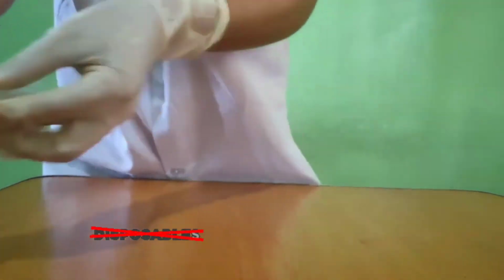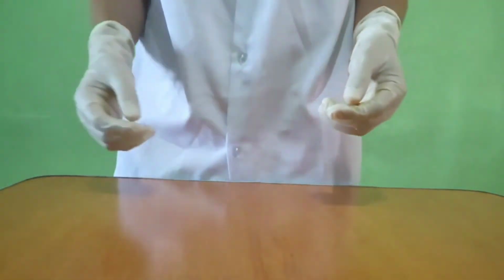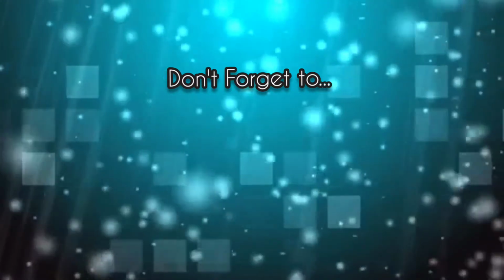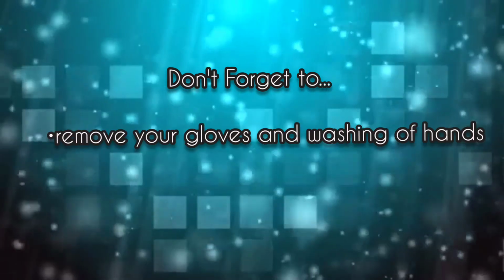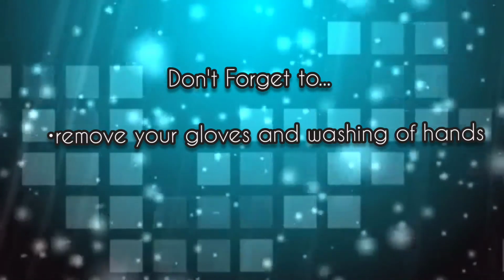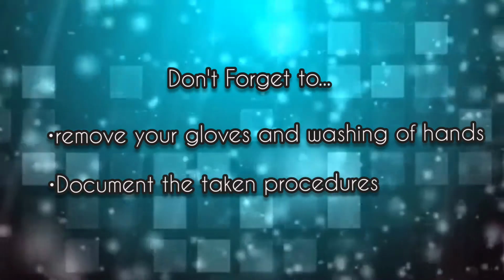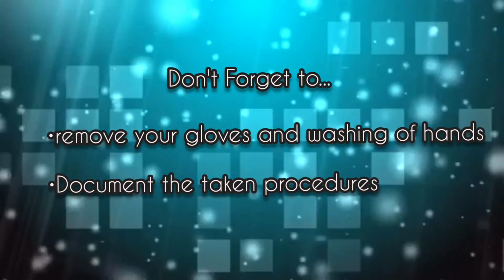After that, we're going to dispose of all the materials used. After disposing of all the materials used in the procedure, don't forget to remove your gloves and wash your hands. And finally, document all the procedures that have been done.